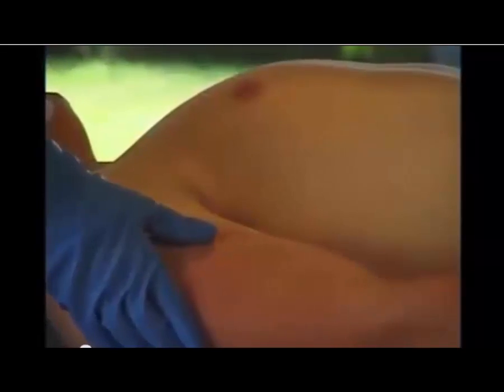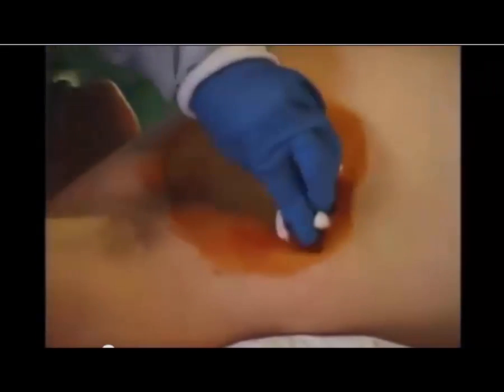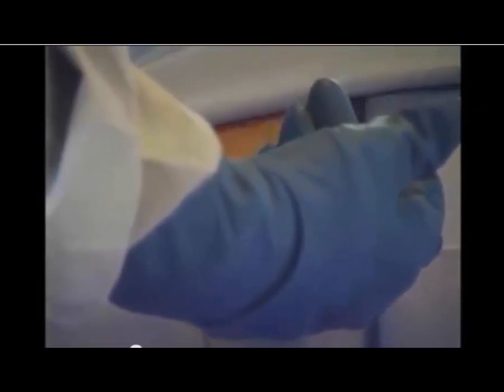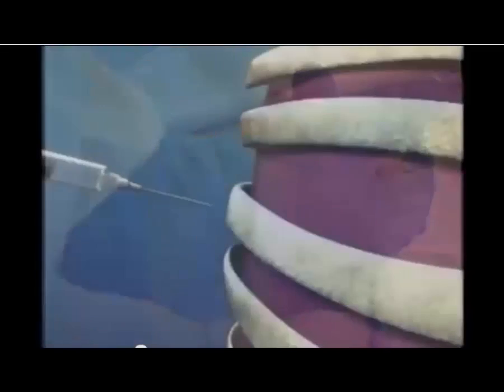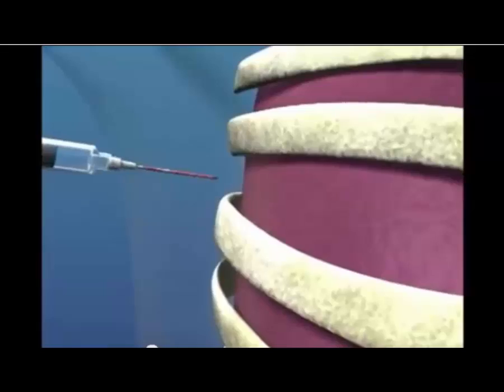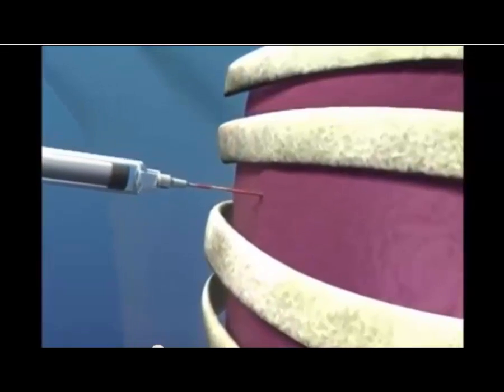With the patient lying supine, position the hand up and over the ipsilateral shoulder and secure it in this position to keep it out of the surgical field. Surgically prep and drape the chest at the predetermined site of tube insertion. Using a small gauge needle, locally anesthetize the skin and subcutaneous tissue and the periosteum of the underlying rib. If possible, the pleura just past the rib should also be anesthetized.